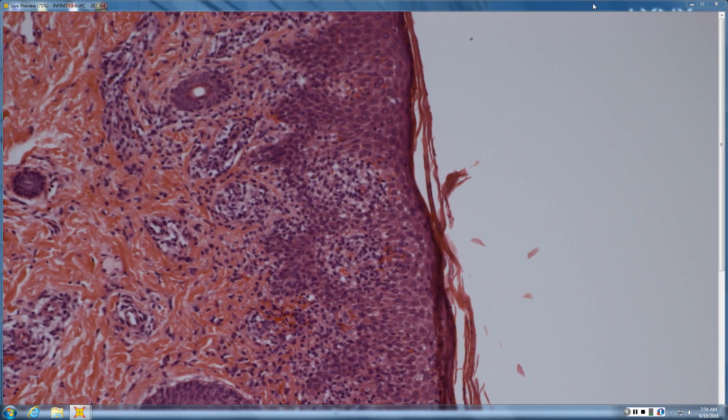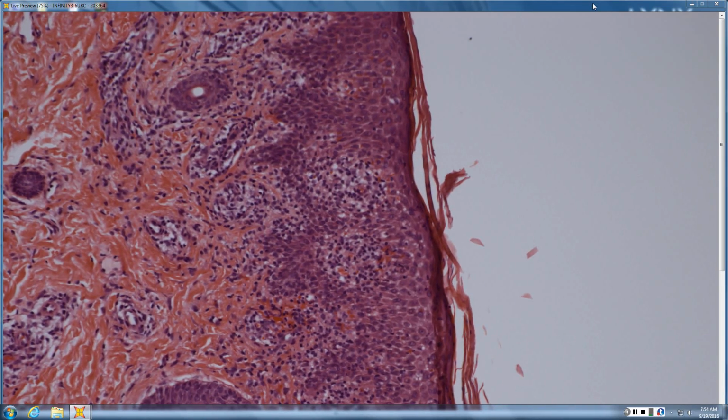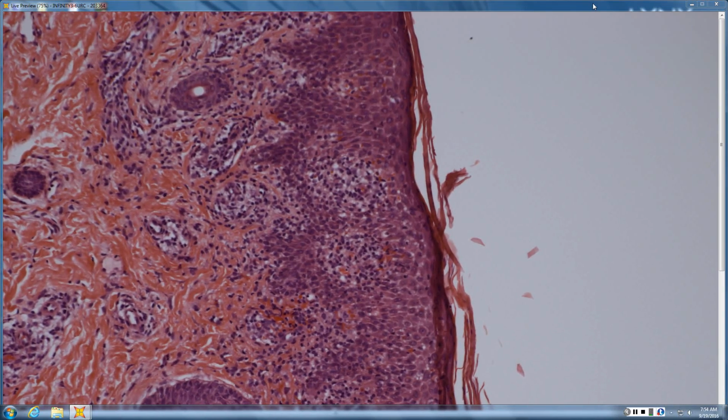So what's your differential of a vacuolar interface with a lymph in every hole? Mycosis fungoides. Yeah, so, lymph in every hole, vacuolar interface, your differential is MF, MF, MF, MF. And then after that, pityriasis lichenoides, early evolving phase of a benign lichenoid keratosis, and then syphilis and drug can kind of fill out that differential. And the red cell extravasation is a big hint to pityriasis lichenoides.